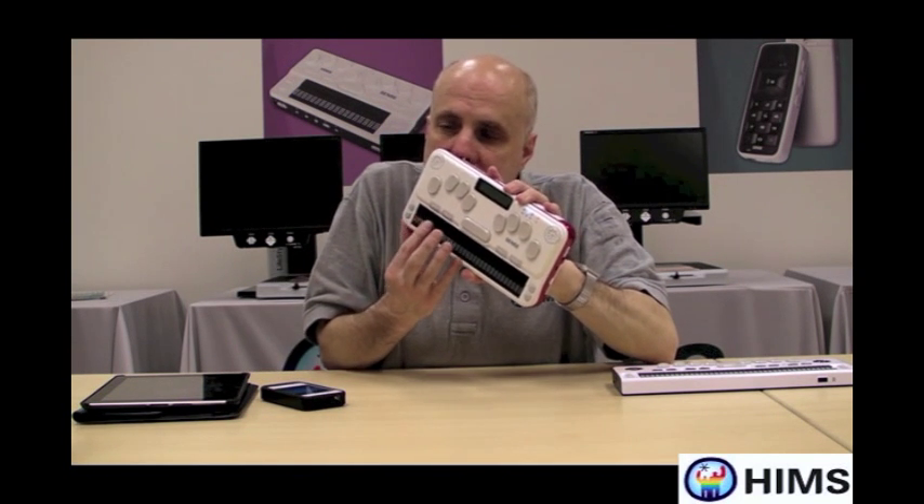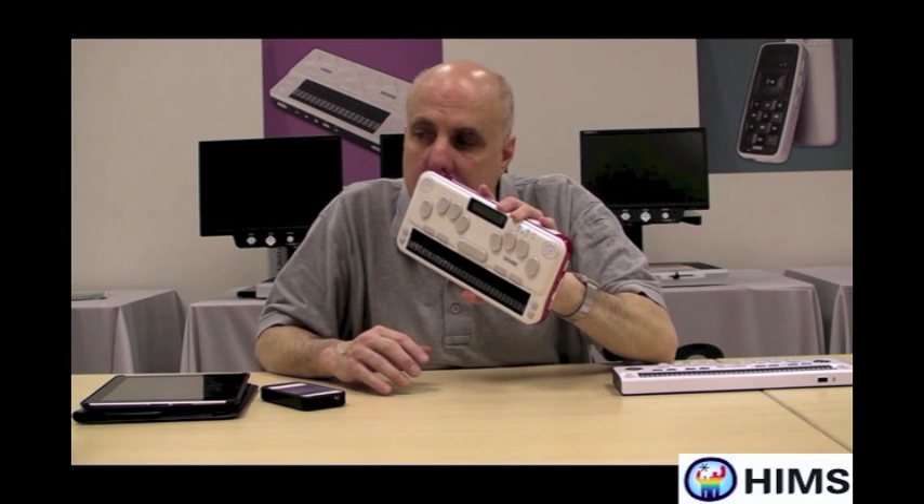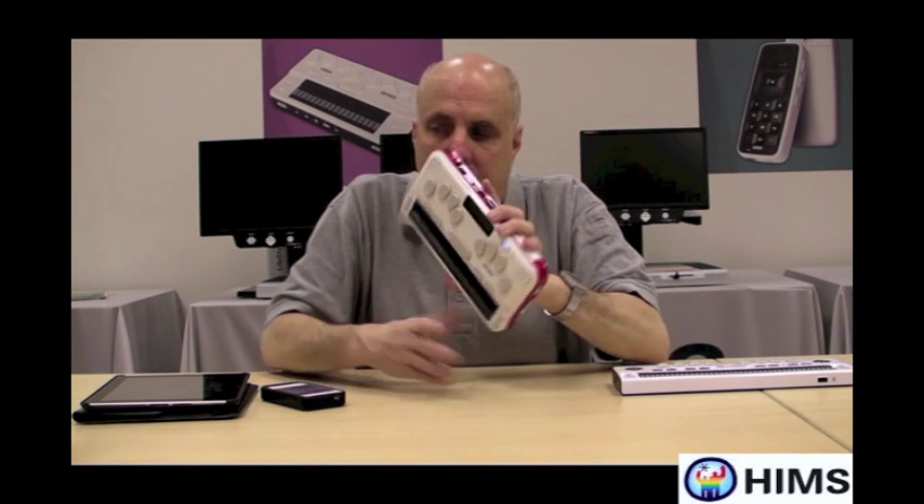So again, you're seeing terminal mode in Braille on the U2. I'm going to go ahead and place this back on the table and use my iPhone to connect it with the U2.